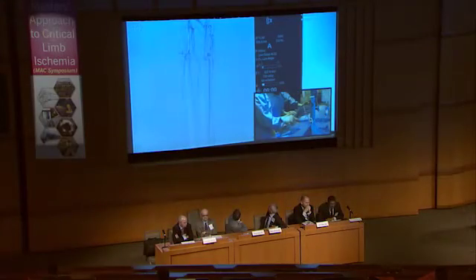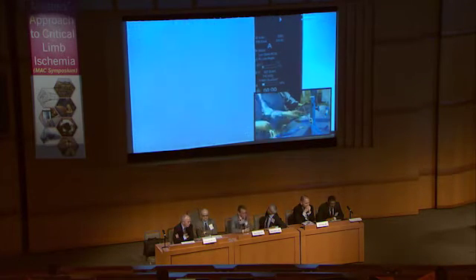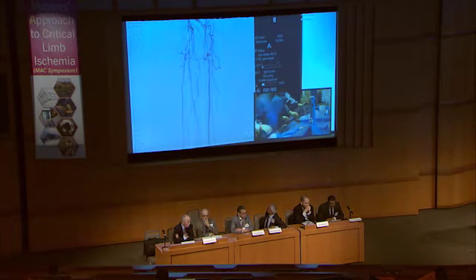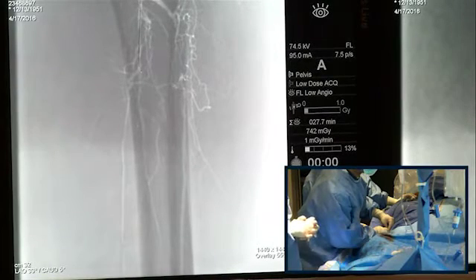I think when you open up the TP trunk, the PT will be easier to see. Yes. Yeah, now I see it. I think this is a very nice feature. It takes a couple seconds extra, but it gives us a lot of help. Okay, Fluoro? Yeah, you can come back a little bit. Pull back your catheter and direct it into the posterior tibial.